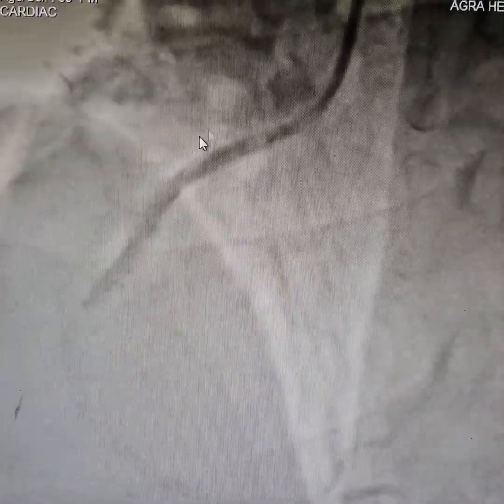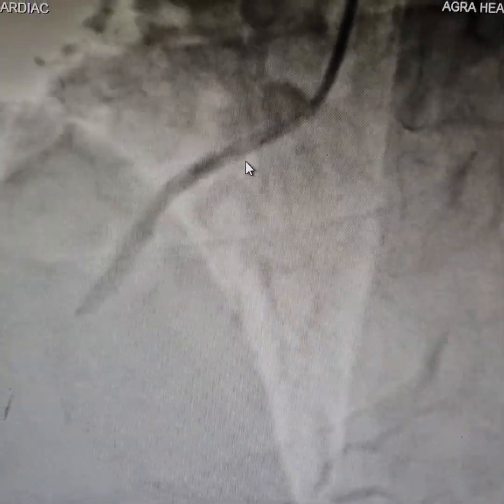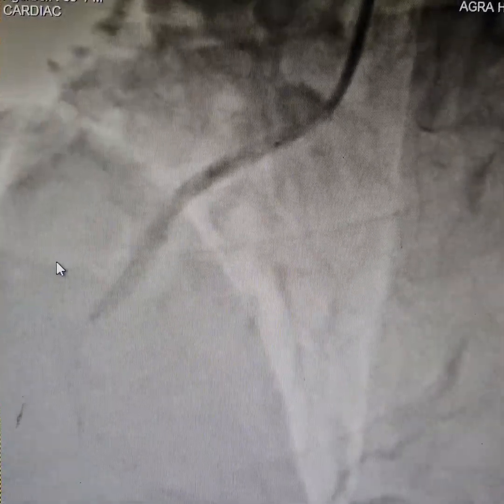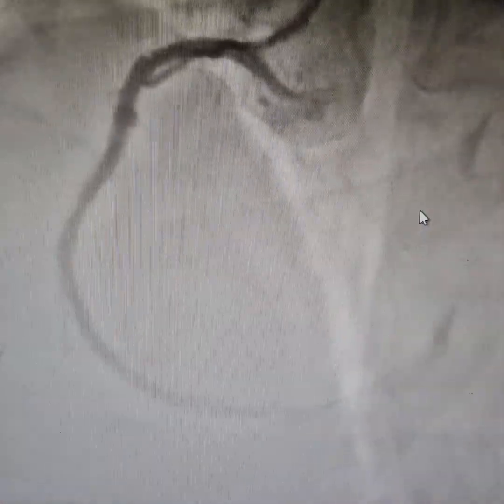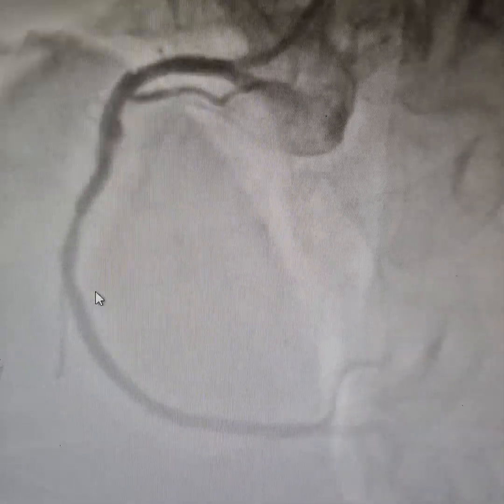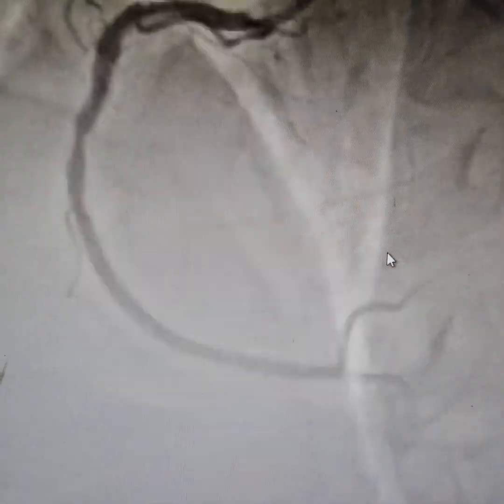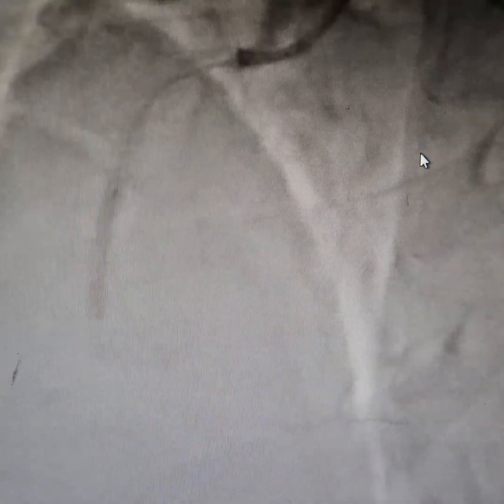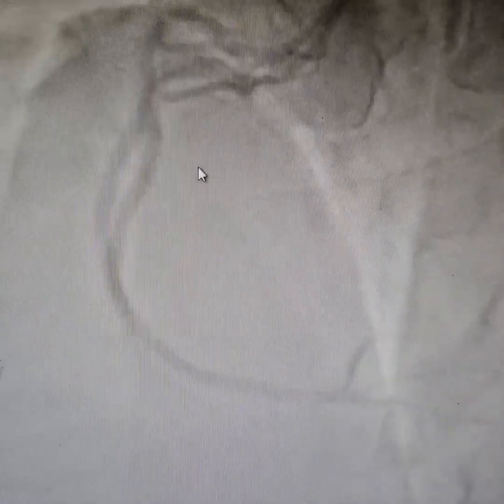We have decided that we will stent from the osteo-proximal part to the mid segment. Good flow has been restored but there is still a 70% stenosis in the mid segment as you can see. So we have decided to put another stent here to cover this. Now deploying the stent, and after some aggressive post-dilation, this is the final result.